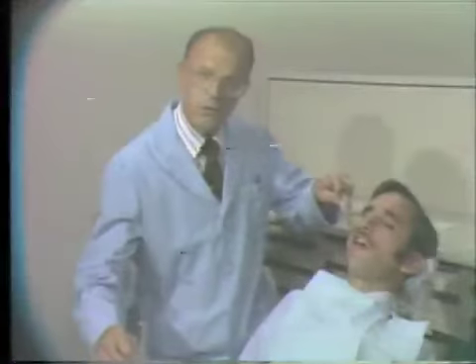As it comes to the surface, the first portion is wiped away with another sterile gauze square, and then the sterile applicator is applied to remove some of the exudate for examination in the laboratory, and is handled in the same way as we did previously in collecting the specimen for culturing from the soft palate. This concludes our section on obtaining a bacteriologic specimen for laboratory examination.